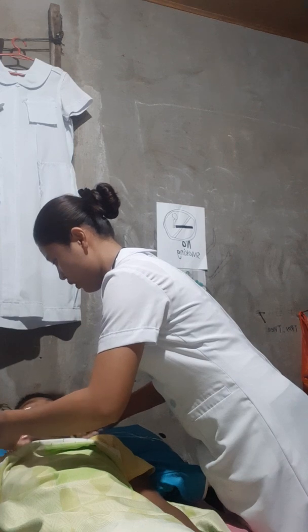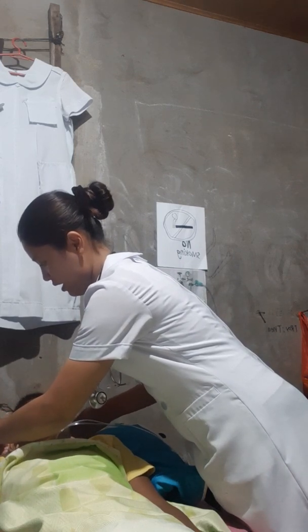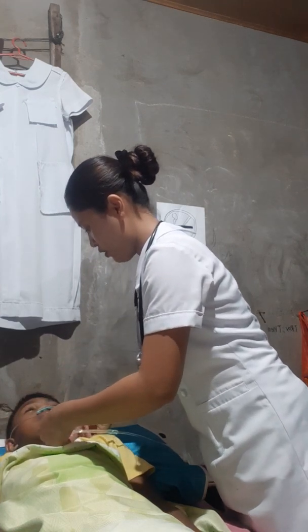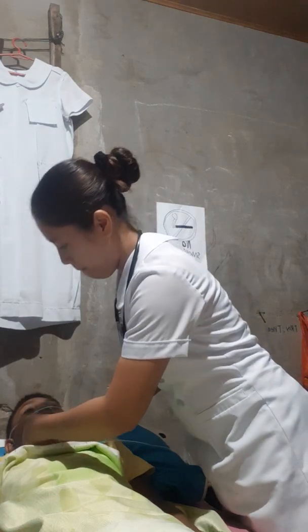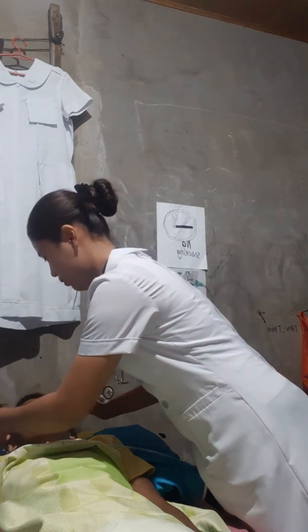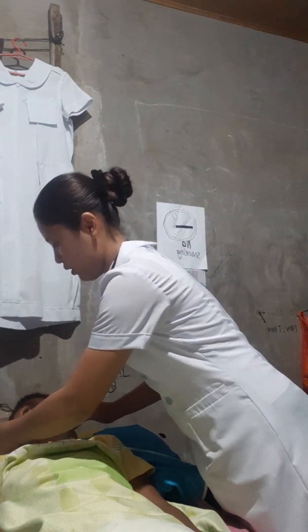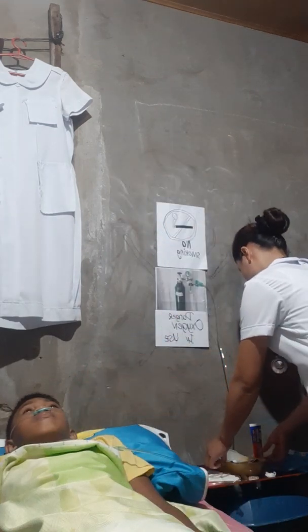The tubing should be at either side of the client's ear. Then the adjuster should be at the chin of the client. If the tubing is moving, we need to secure it.